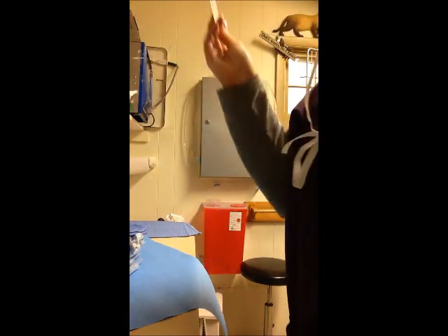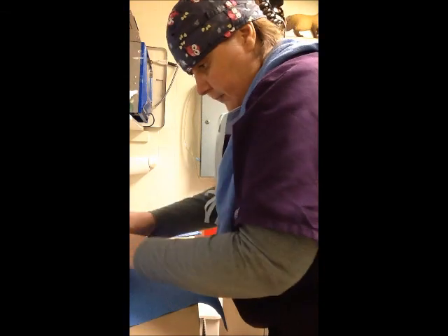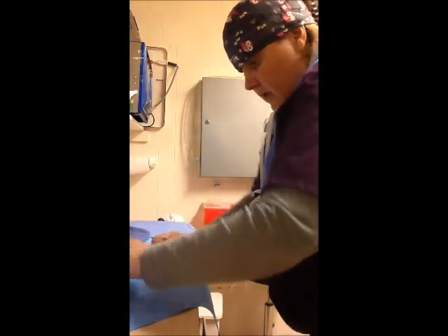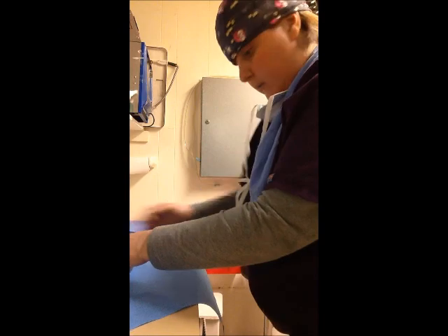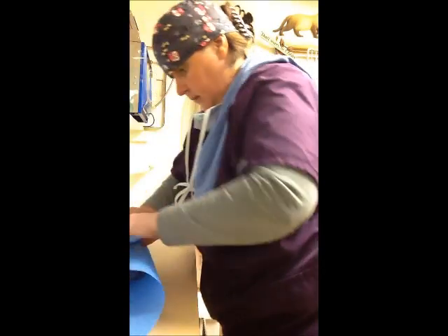And then it is going to be the same envelope pattern that we had for our pack earlier. This is going to get pulled through here. And this is our indicator strip, so that when the doctor opens the pack up, or when the technician opens the pack up, she can see right away what the indicator strip will show, whether or not it is sterilized.